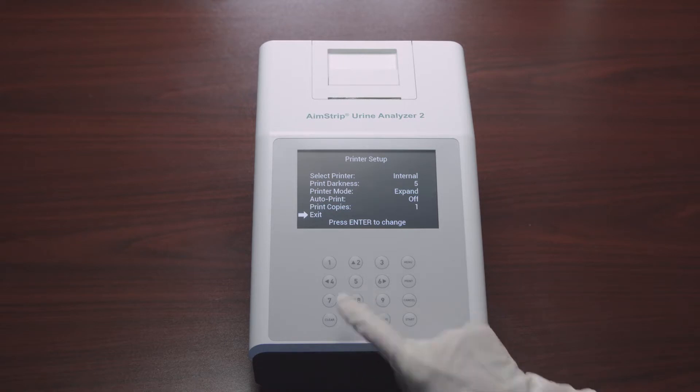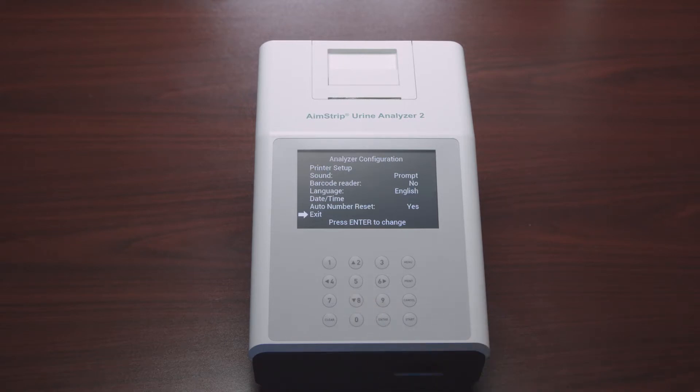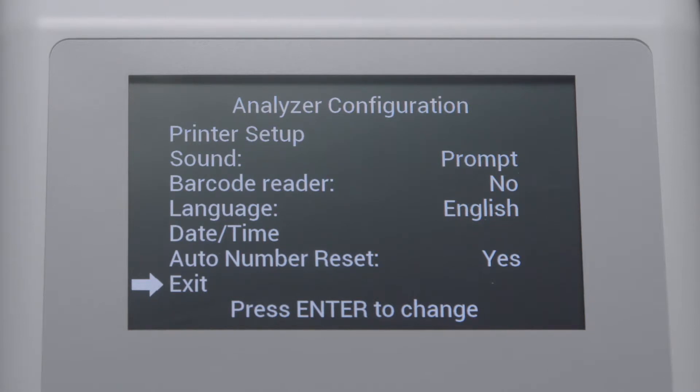Once you've finished your selections for the printer setup, select Exit and press Enter to return to the main menu. You are now back in the Analyzer Configuration screen. Select Sound and press Enter to cycle the options to Off, On, and Prompts. You also have the ability to use a barcode reader: select Barcode Reader and press Enter to display Yes to allow use of a barcode.